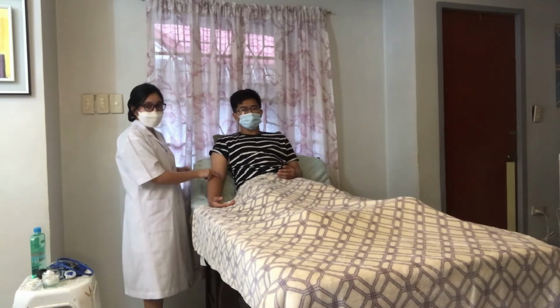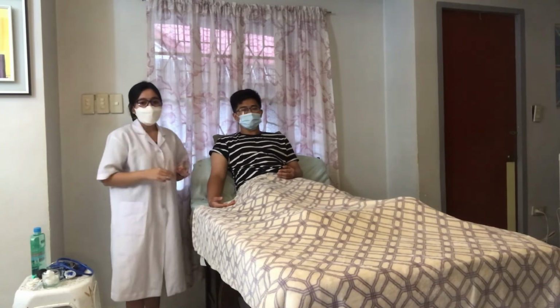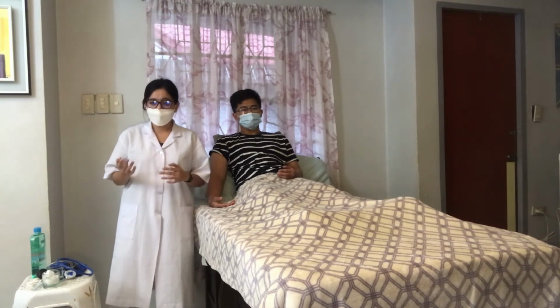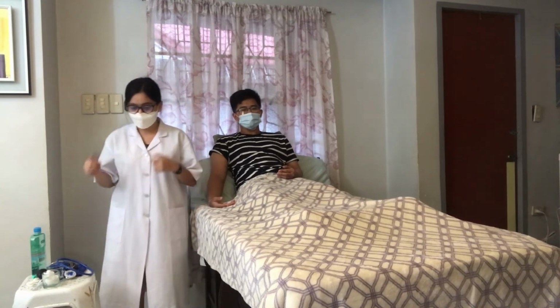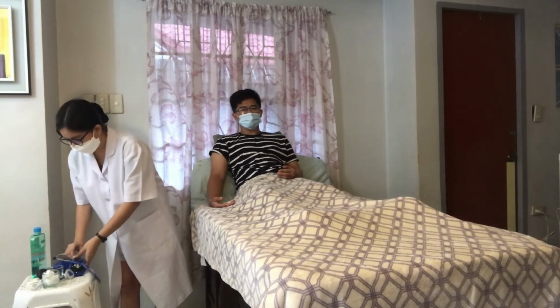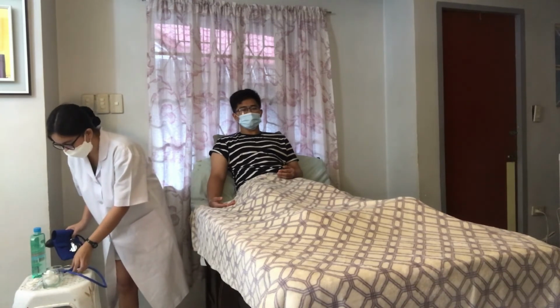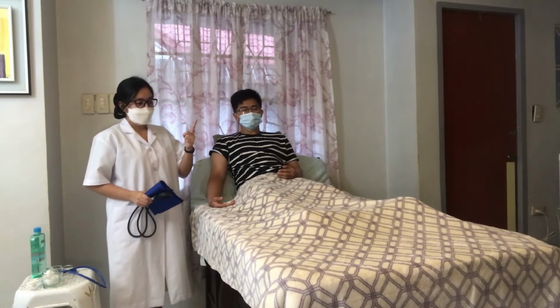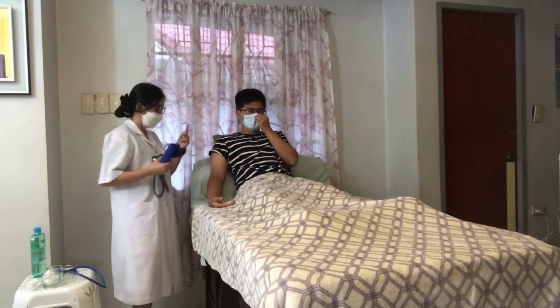Now after identifying the brachial pulse of the patient, we are then going to smoothly and evenly apply the cuff with its lower border located at about 2.5 centimeters above the antecubital space. For the measurement of 2.5 centimeters, we can just use our index finger and half of the third finger.